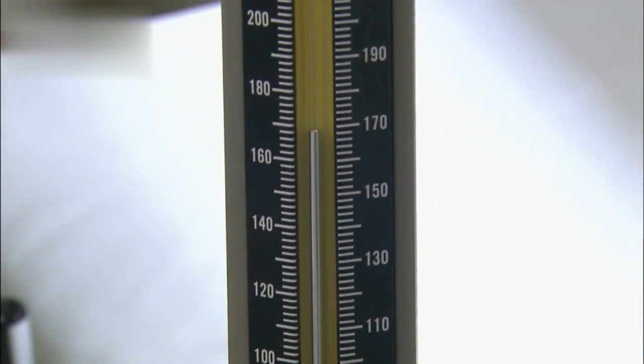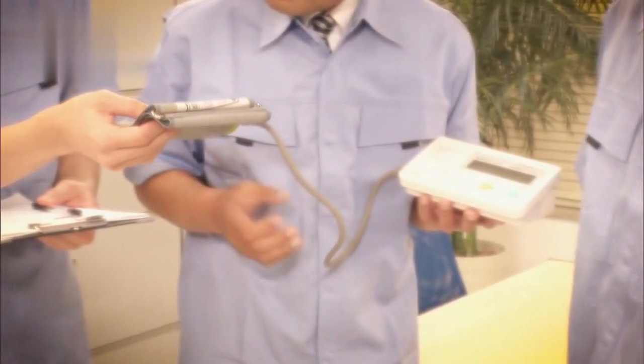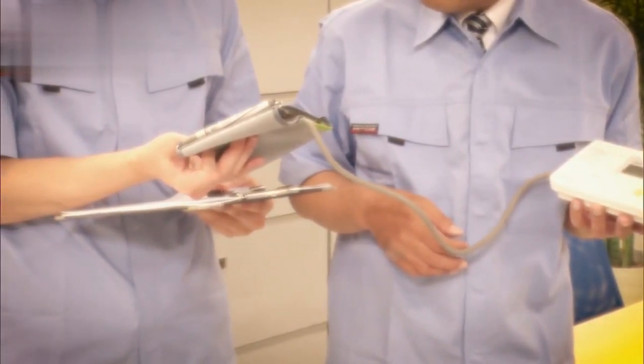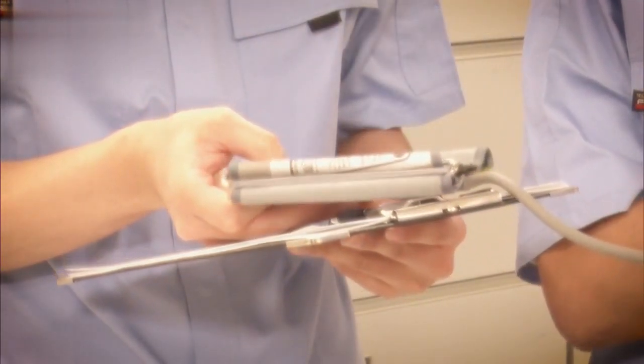The company believed that blood pressure fluctuated considerably. It wasn't accurate to just measure it at a hospital on occasion. The company wanted to start a culture of measuring blood pressure at home and collaborated with the university hospital. The company thought the outcome of the study might also increase demand for home blood pressure monitors. They decided to develop a new product that more people would want to use.